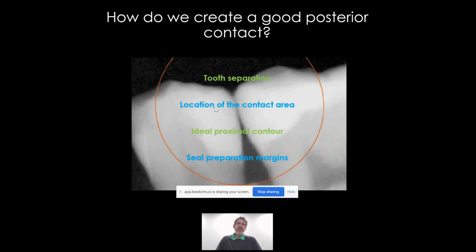And that's primarily because of two reasons. Number one, you haven't got a good seal at the gingival margin and you've got sulcular fluid contamination, or the curing light that you're using isn't providing you with sufficient energy to cure that composite. Because we know that most curing lights, when you move as little as 1 centimeter away, you lose about 60 to 80% of the energy of the light. And that's before you've even placed a composite material.